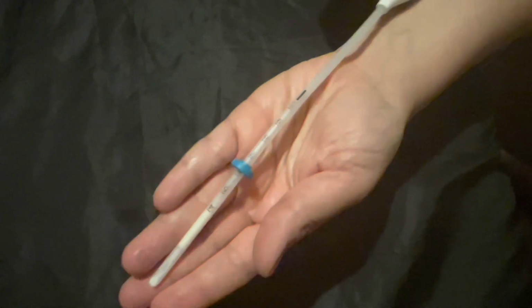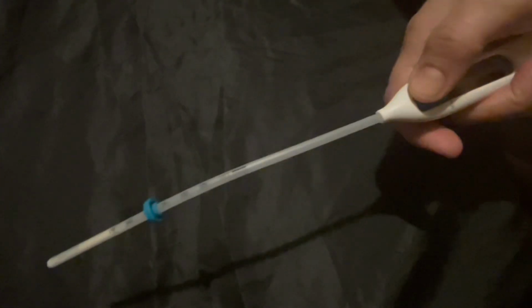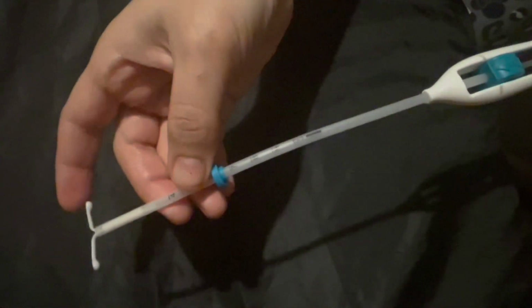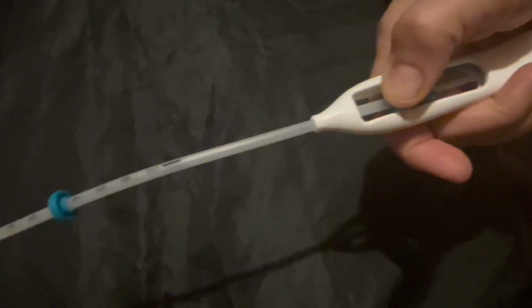So you take the whole tube backward by 1 centimeter to give space for the arms to come out, and then bring it back to the original point, to this mark. As you can see, the arms are now released. Then you push it to the fundus again, and now we need to release the whole coil by taking the whole thing downward.